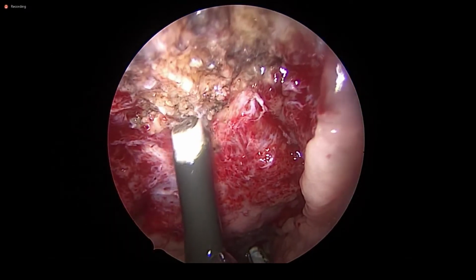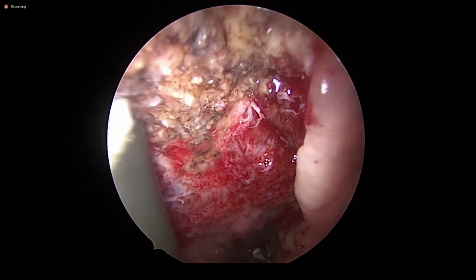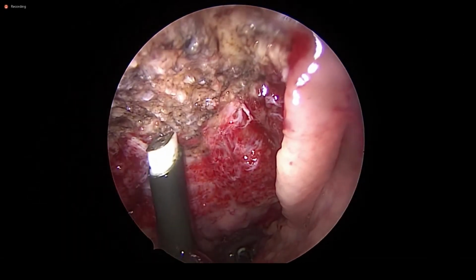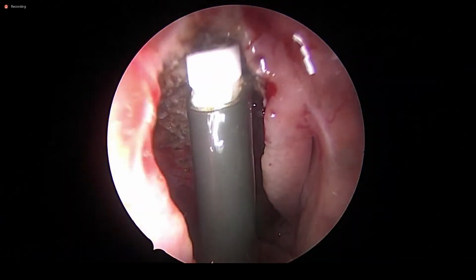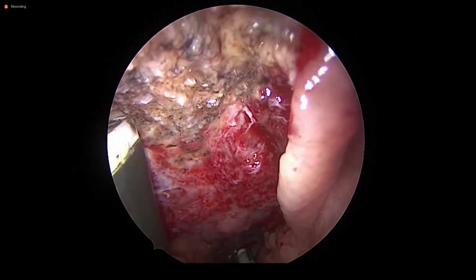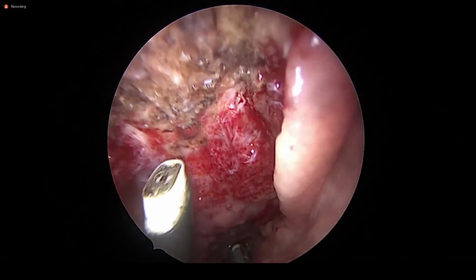To prevent charring of this muscle and the periosteum, we resorted to the microdebrider in spite of a little bit of bleeding that goes on. Can you see this? Yes, sir. This is carpet coagulation, because all post-operative hemorrhages can come only from the periosteal region, not from the muscle. See how it looks.